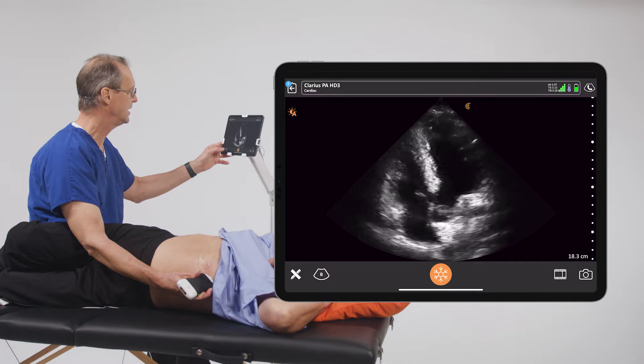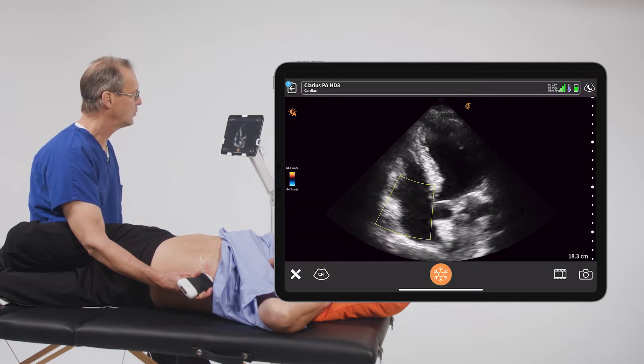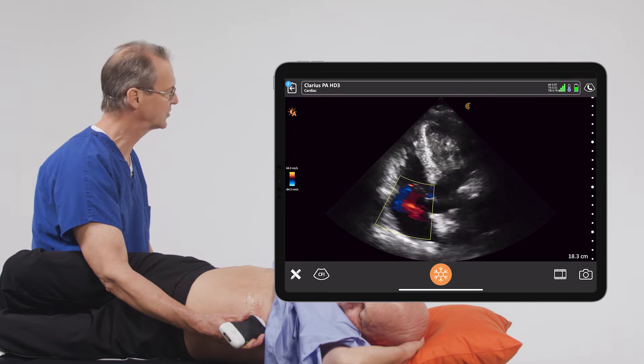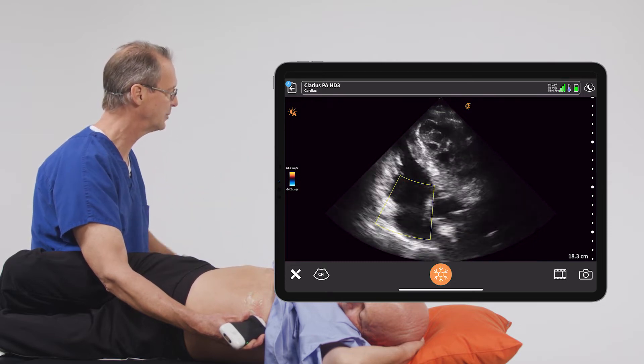At this point, we're going to go ahead and use color doppler. And when we turn on color doppler, we notice a couple things right away. The first is that we're given this color box, and this is the only part on the screen where we're going to see color doppler images.